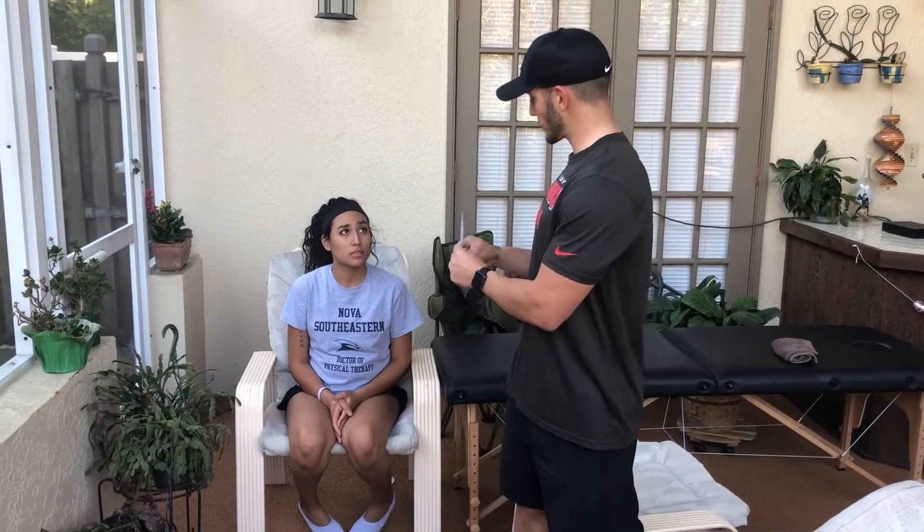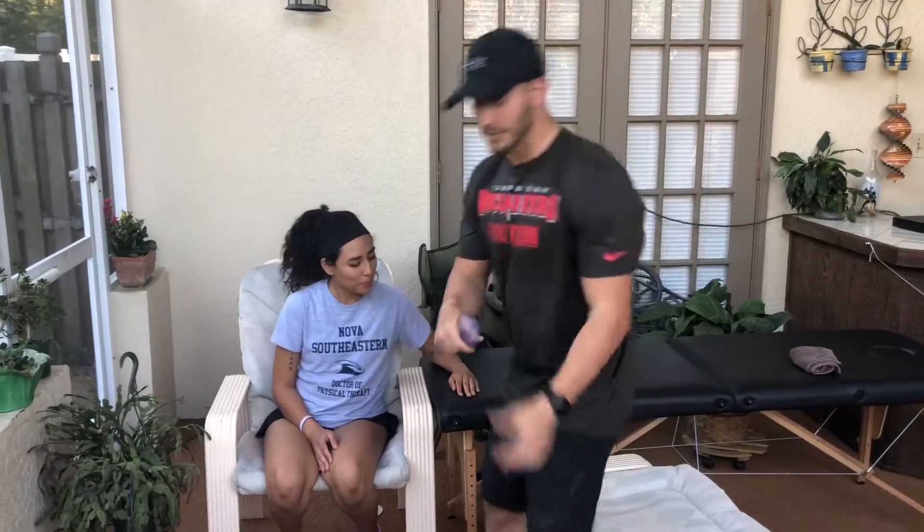I'm Simon Wade, I'm a student in physical therapy. Mags, do I have your permission to take a video measuring some range of motion? Yes. This is for my classmates and my professor.